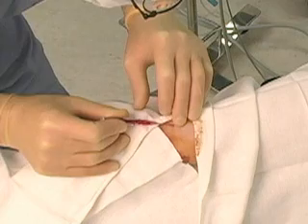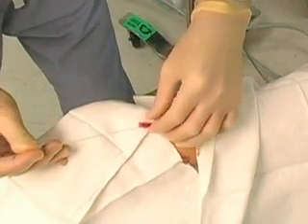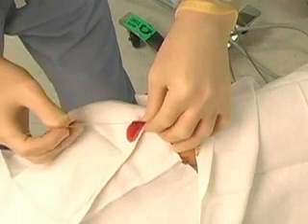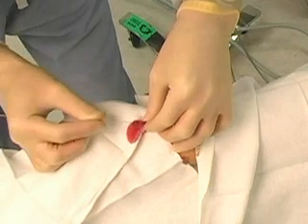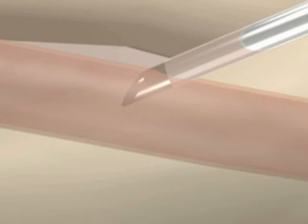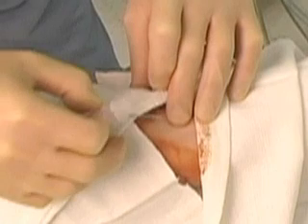If, in the over-the-needle technique, no blood return is obtained after the initial flash, the catheter can be advanced through the vessel and the over-the-wire technique can be employed. Occasionally, free flow of blood is observed, but the catheter will not pass easily. In the animation, you can see how the tip of the needle might be within the vessel, while the catheter remains outside. By advancing the needle slightly farther after the initial flash of blood, the catheter can enter the artery, allowing for successful cannulation.